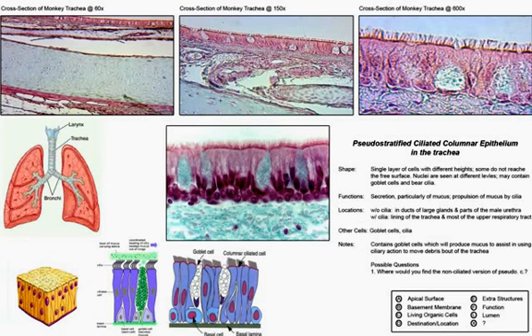You can see on the edges of the cartilage, further magnified here, when we look at this, you see chondroblasts that are differentiating, pushing as they mature, leaving that differentiated new chondroblast in its place, and then maturing and moving to the center in its lacunae in a rigid matrix that contains GAGs, chondroitin sulfate, hyaluronic acid, and water as the matrix that's hardened and resilient to any stress or strain that's placed on it.